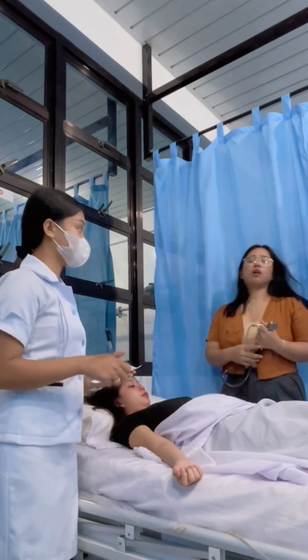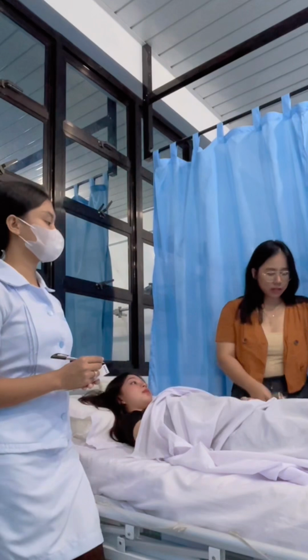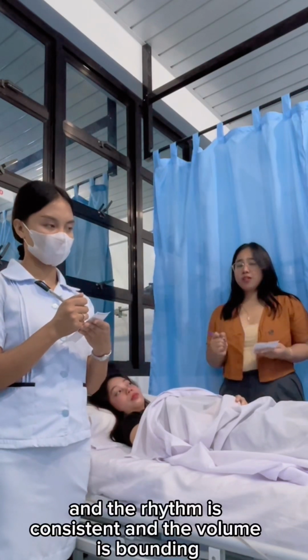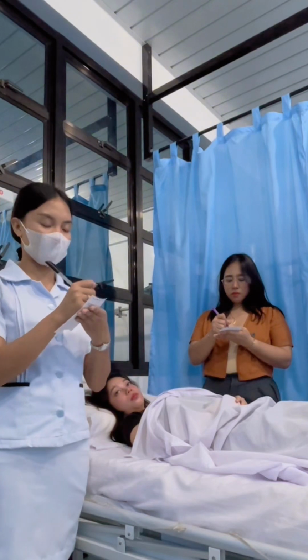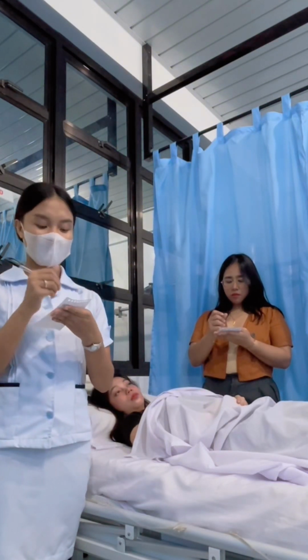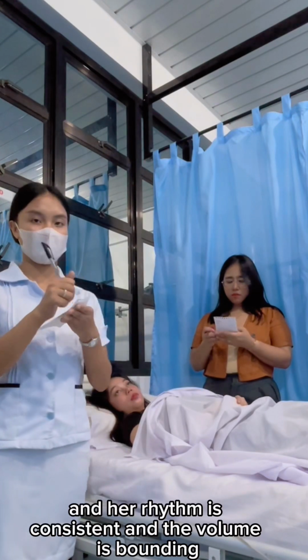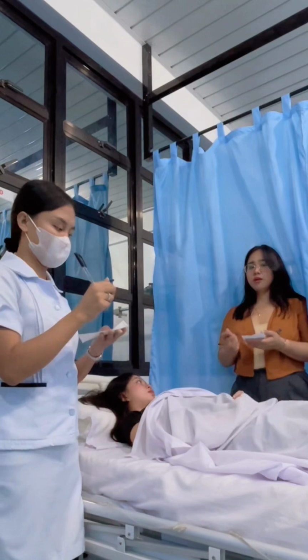So after we take the radial and apical pulse of the patient, let's document the result. I get 64 beats per minute for the apical pulse, and the rhythm is consistent, and the volume is bounding. For the radial pulse, I also get 64 beats per minute, and her rhythm is consistent, and the volume is bounding. That's all.